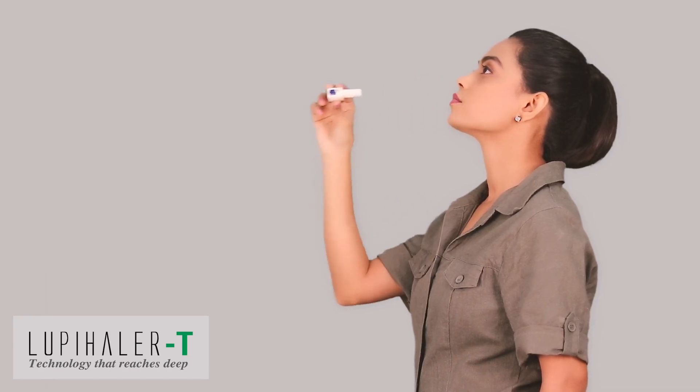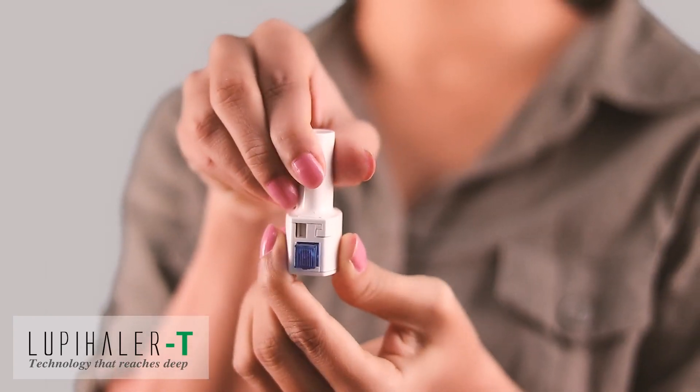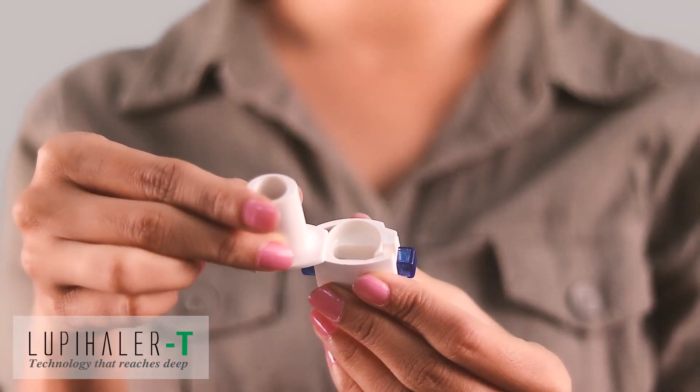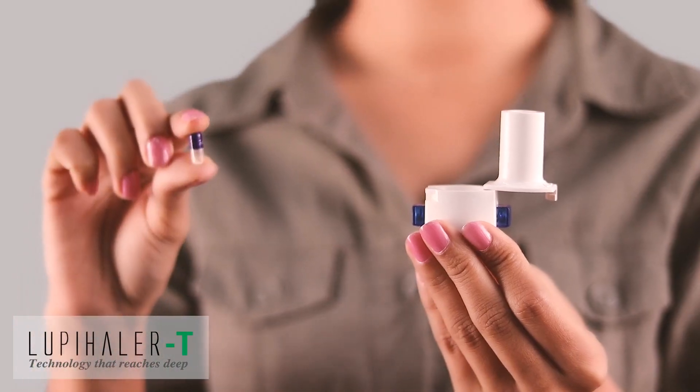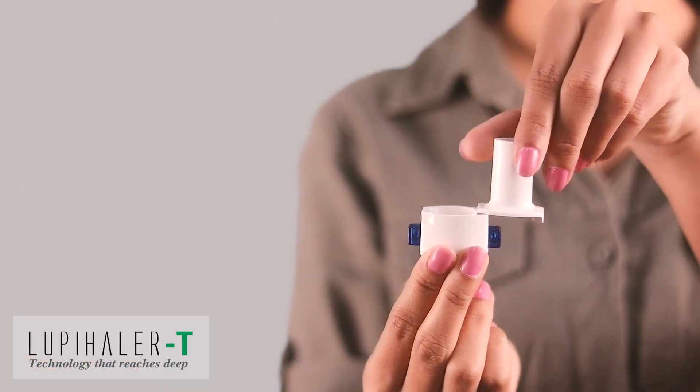Get the Lupehaler T out of your mouth. Hold your breath for 10 seconds or as long as is convenient. Exhale slowly through your nose. Open the mouthpiece and throw away the empty capsule. If you see little medicine left in the capsule, close the mouthpiece and repeat the step.